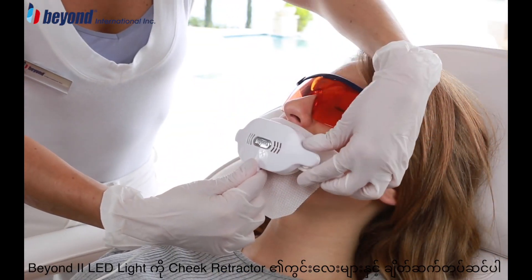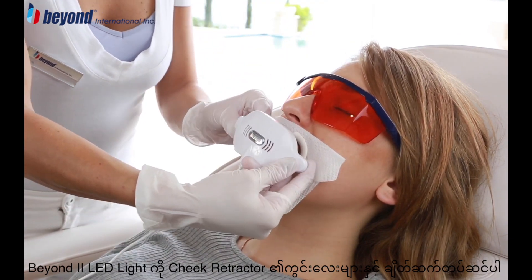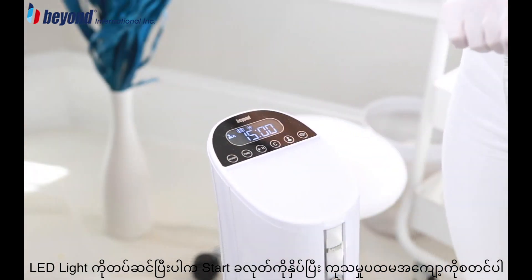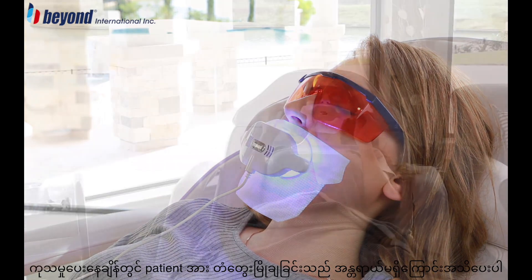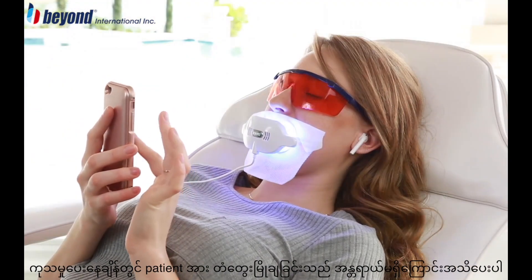Attach the Beyond 2 LED light to the cheek retractor and connect the two using the brackets on the retractor. Once the LED light is attached, press the start button to begin the first cycle. Provide the client with music or entertainment during the treatment and remind the client that it is safe to swallow their saliva.